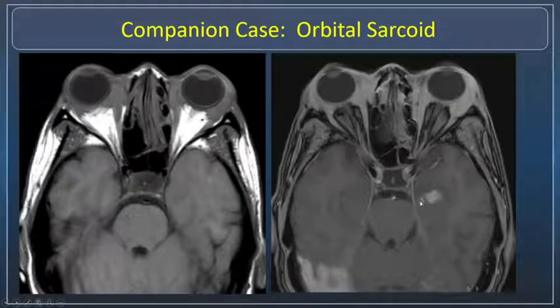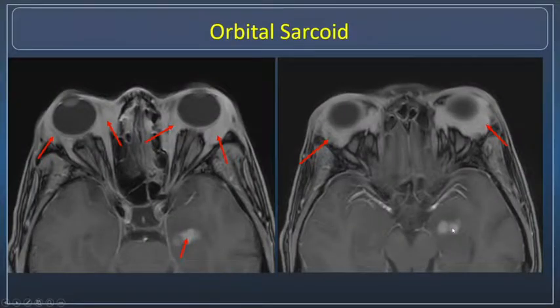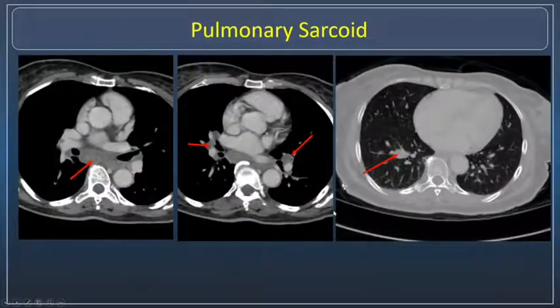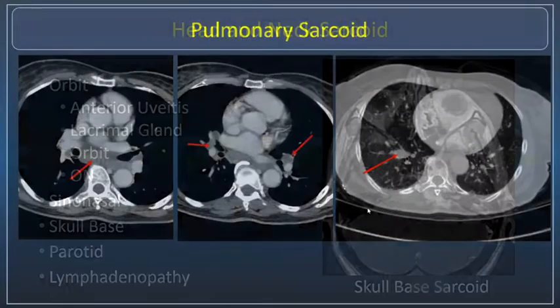And also notice in this particular case, there's marked involvement of the intracranial compartment as well. There's dural disease. You can see lesions tracking along the tentorium on the right, and on the left there's disease involving the uncus. Looking down in the spine, there's additional areas of involvement in the mid-thoracic spine as well in this patient with diffuse systemic sarcoidosis as well as neurosarcoidosis. And then of course in this same patient there's a typical involvement, subcarinal adenopathy, bilateral hilar adenopathy, and some nodules in the lungs as well.